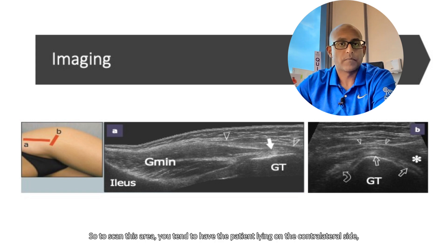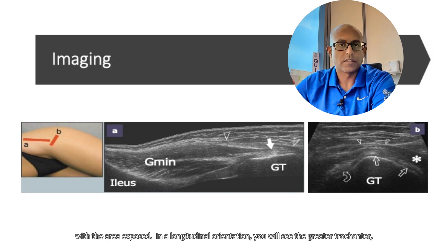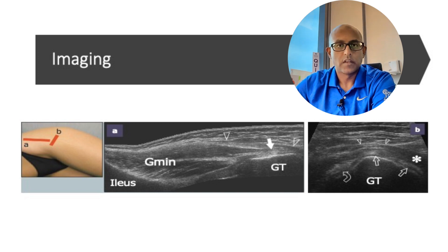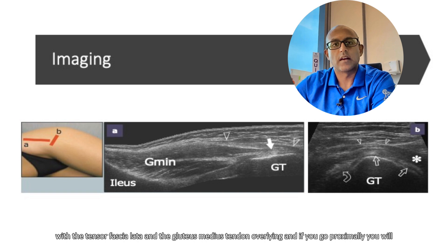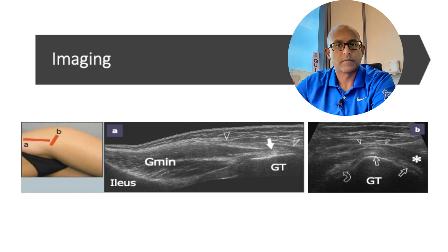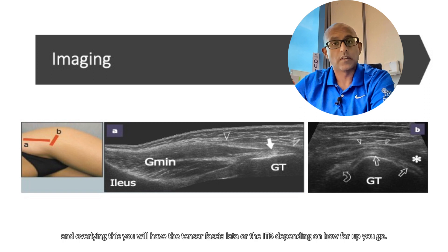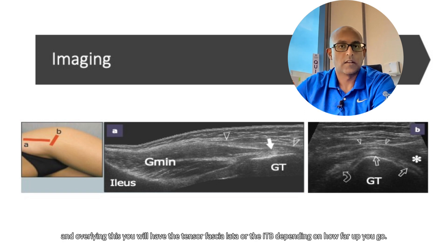To scan this area, you tend to have the patient lying on the contralateral side with the area exposed. In a longitudinal orientation, you will see the greater trochanter with the tensor fasciae and the gluteus medius tendon overlying. If you go proximally, you will see the gluteus minimus. In a short axis orientation, remember there are the facets of the greater trochanter — anteriorly you have the gluteus minimus, over the middle facet you have the gluteus medius, and overlying this you will have the tensor fasciae latae or the ITB, depending on how far up you go.